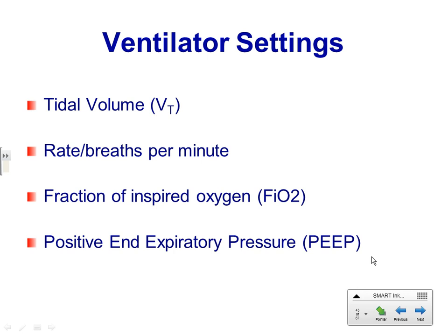And then positive end expiratory pressure, keeping those alveoli open at the end of expiration, because that's when they're at risk for collapsing. And that patient that has ARDS or other types of respiratory conditions that weaken the alveoli, that PEEP is going to help keep the lungs, the alveoli expanded.